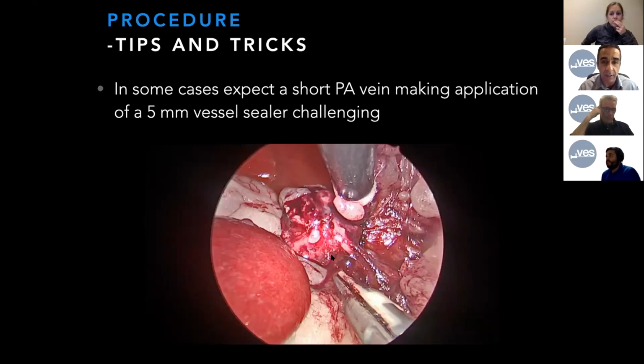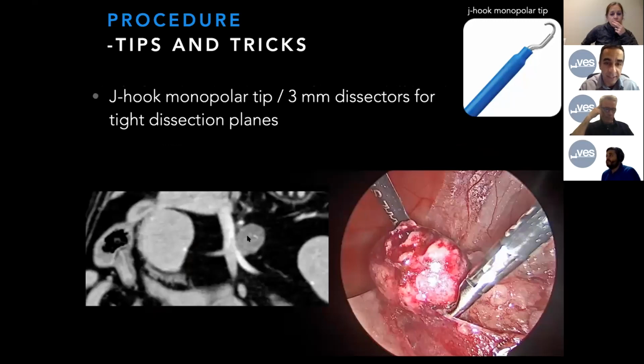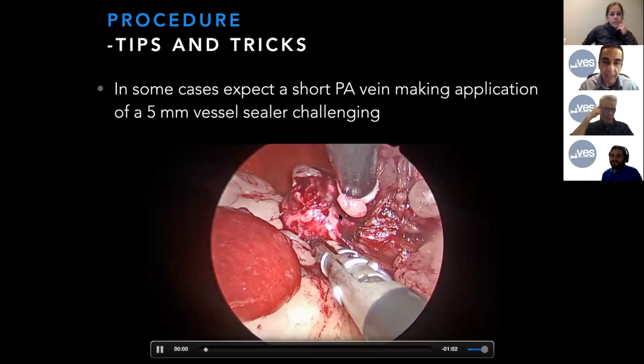It's the same video I'll show based on this CT. There's really no length of the PAV that you can see on this CT. And certainly once you're dissecting caudally and stretch this out, you will see some. Just get to the video, but this is really difficult. And so we've isolated the phrenico-abdominal vein at this point.